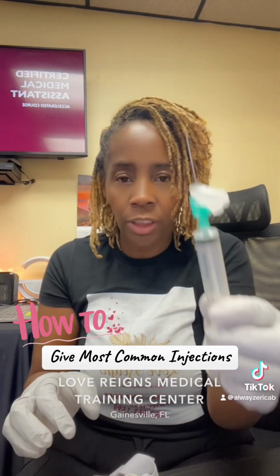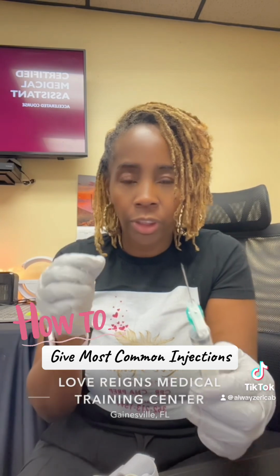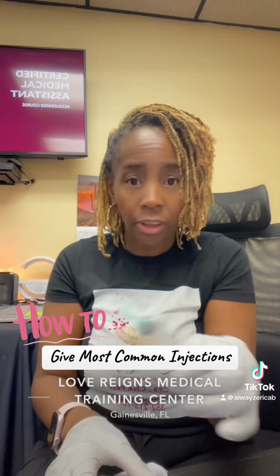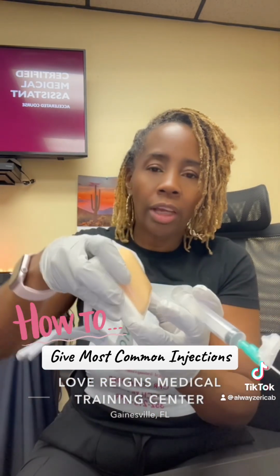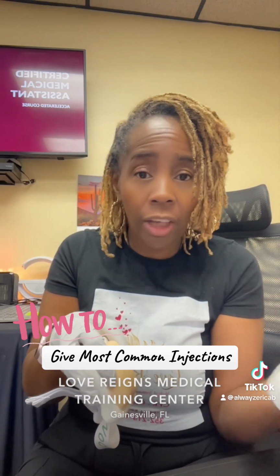You should never be taking this in a room with a patient to give an injection if it doesn't have an activation device. The insulin and the other ones sometimes don't have one, but these should always have an activation device. All of them should if you can, okay? But now I want you to know that we're going to go on a 90-degree angle that's ready to go. I would have already asked if they have allergies. I would have asked them where they prefer to have it, all the things, okay?